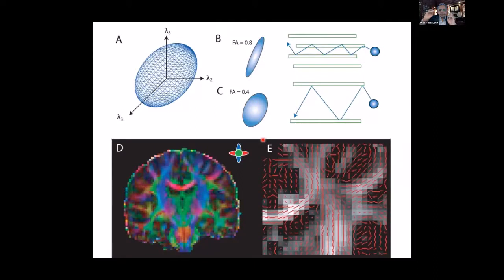They can give different signals, because when the RF pulse is given and the signal is obtained in the T1 and T2 relaxation, that molecule might have moved somewhere else because of that Brownian motion. That's why in an edema, in an infarct, there's so much swelling that Brownian motion is limited, and that is picked up. Now in DTI, in a free space, it's the same principle. In a free space, a water molecule is moving around, but in those areas where there are fiber tracts, axons, it will limit its movement.